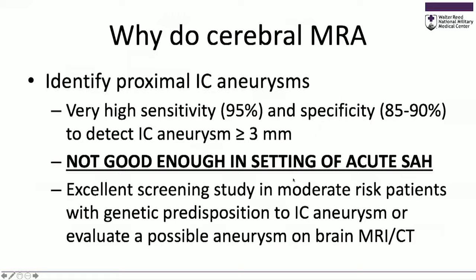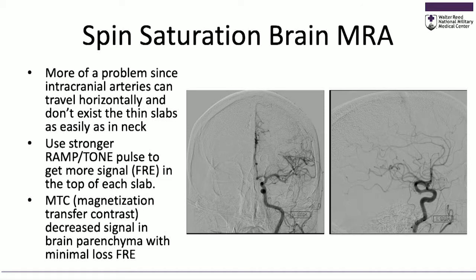However, it is an excellent screening modality in patients at moderate risk, such as those with a genetic predisposition, or where you have a finding on MR or CT that makes you wonder if there's an intracranial aneurysm. We had an excellent discussion this morning on time of flight imaging, and I'll have a few schematics to discuss in Dr. Houston's section when we get to the neck.